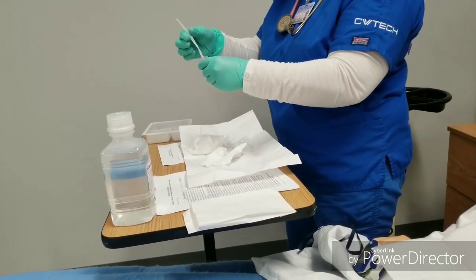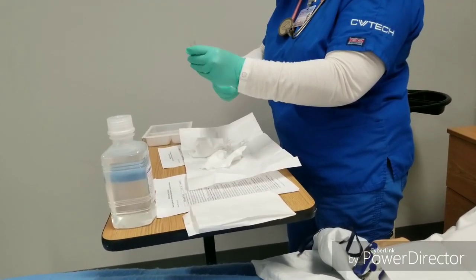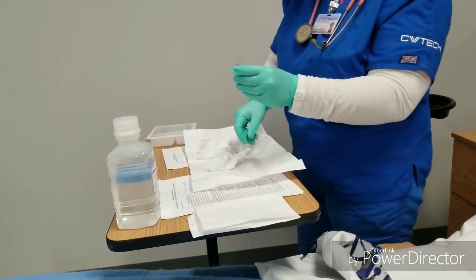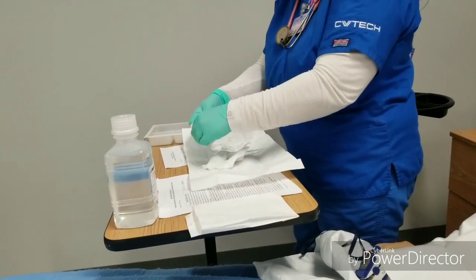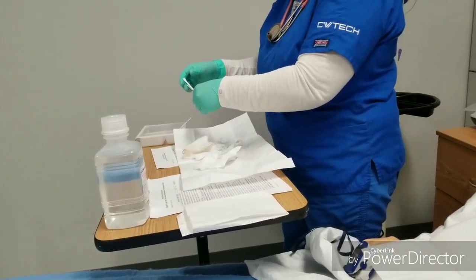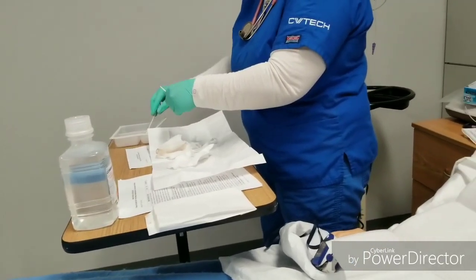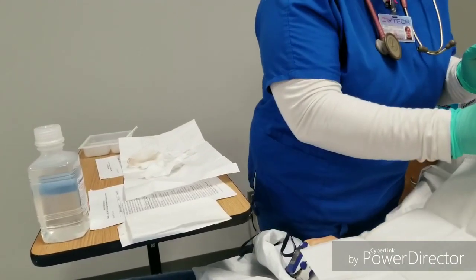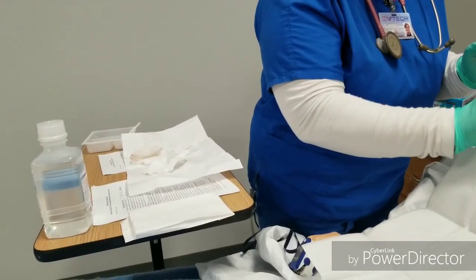Do that a couple of times so you can get good and dry. Dry the outside again. These Q-tips will go in their 3rd fill of saline, and they're for cleaning around this.